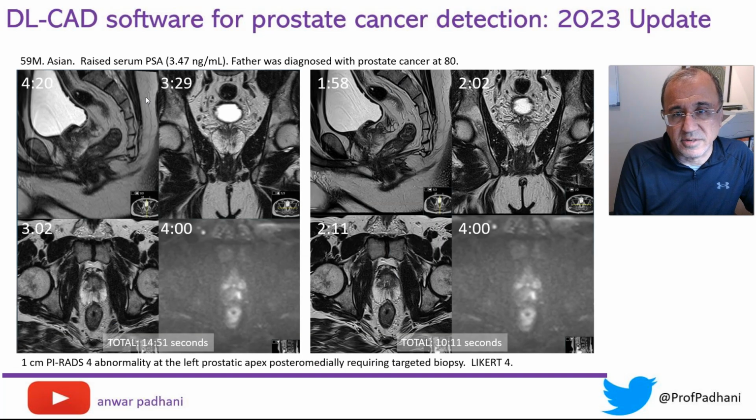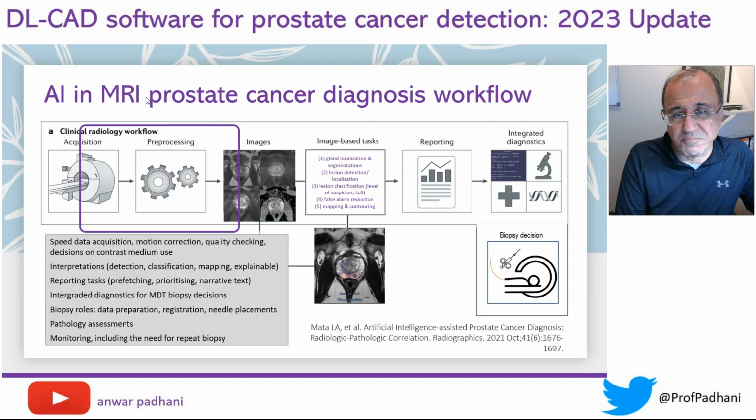is much better. And this is applied in all three planes in this particular example, and you can see how the sagittal sequence on this occasion is markedly improved, and of course there is a quality improvement in the other T2 planes. You'll notice I haven't applied the AI for the diffusion sequence at this time.